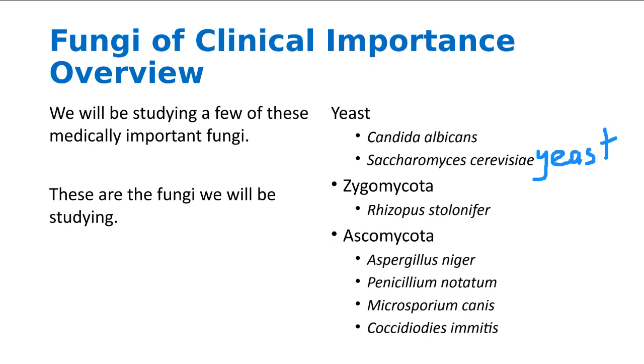Candida albicans has some special structures that will help you identify it, so it's going to be easy to do so. The other organisms are the Zygomycota and the Ascomycota. These organisms are less evolved, right? So we simply call them the lower molds, if you will. And the Ascomycota are higher. They're more evolved. And the evolution of these things is going to be based on their mycelia.